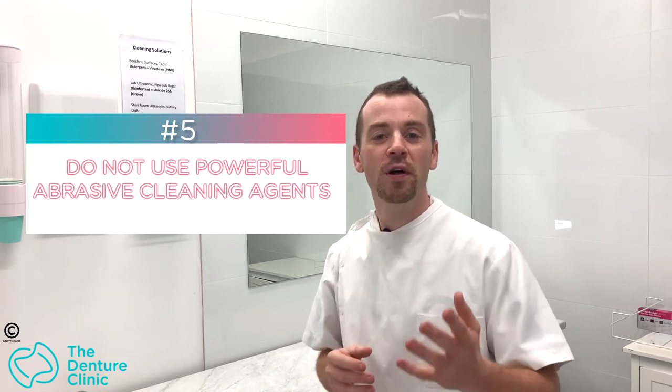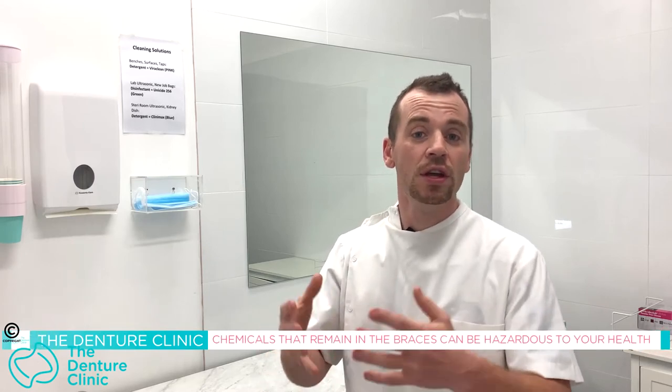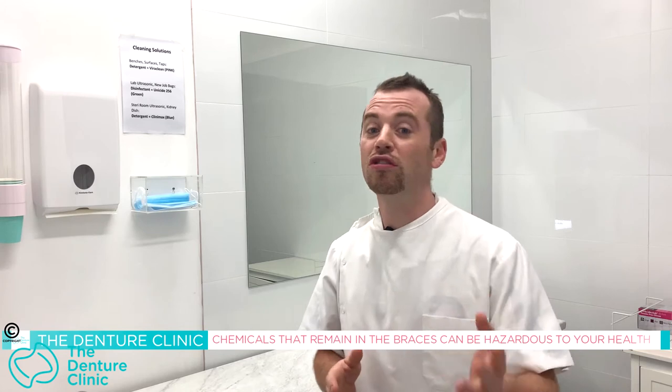Tip number five: things you shouldn't do to your denture — using powerful abrasive cleaning agents. Things from the bathroom, kitchen, or laundry are designed to get rid of mold and residue, not food and plaque. Don't use those on your denture. We also don't know what those chemicals contain, and they could still be present even after rinsing — then you place them in your mouth. If you're sensitive to chemicals, you could do yourself a world of harm. If it's from the hardware or grocery store, it's not meant for dentures. The best thing is soapy water and toothpaste.